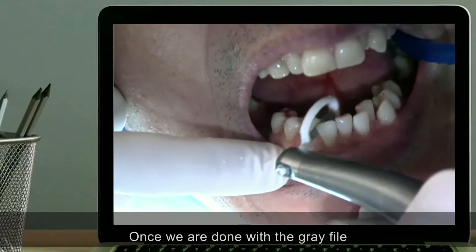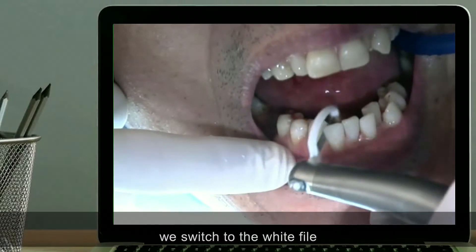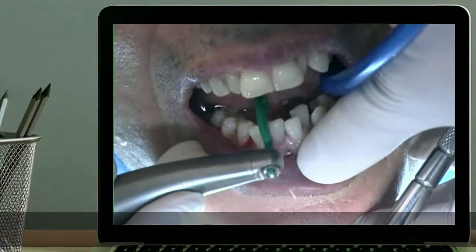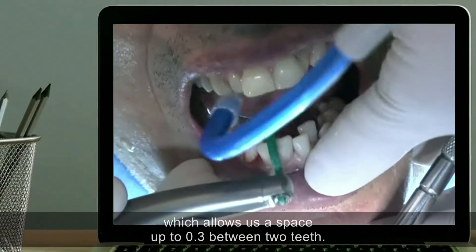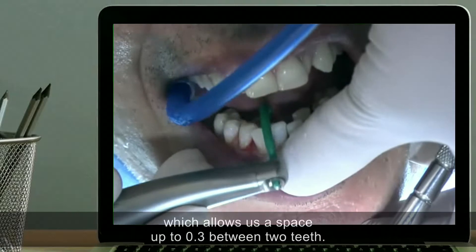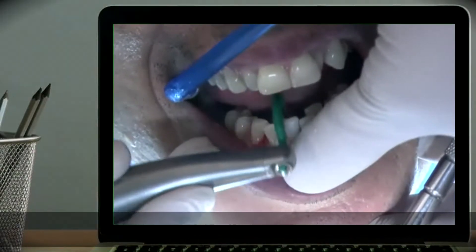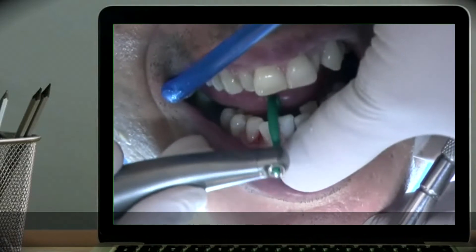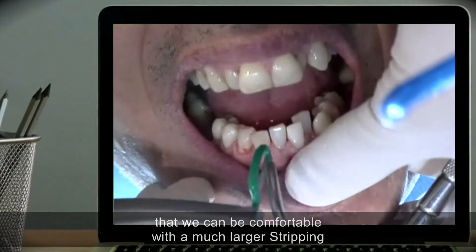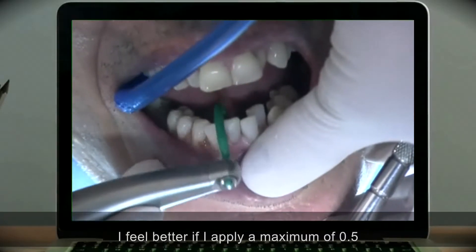Once we are done with the grey file, we switch to the white file, which is my second most used one. And then the green file, which allows us a space up to 0.3mm between two teeth. If we want more, we can use other files. Although Sheridan tells us that we can be comfortable with a much larger stripping, I feel better if I apply a maximum of 0.5mm per interproximal space.